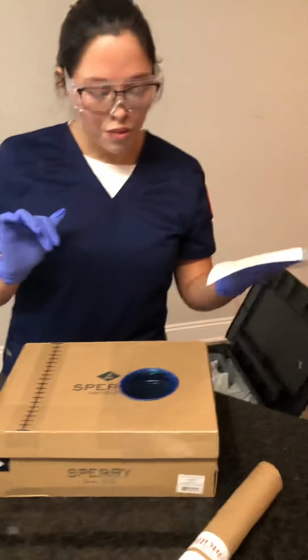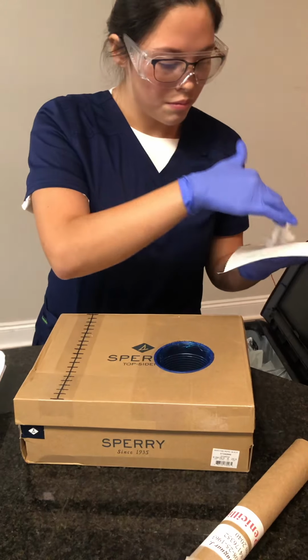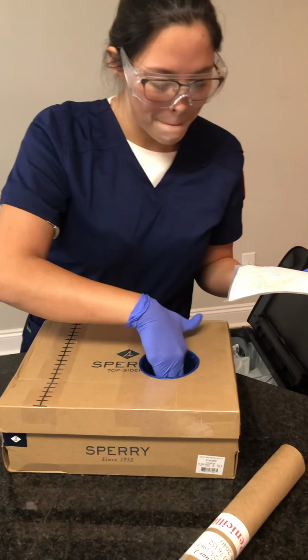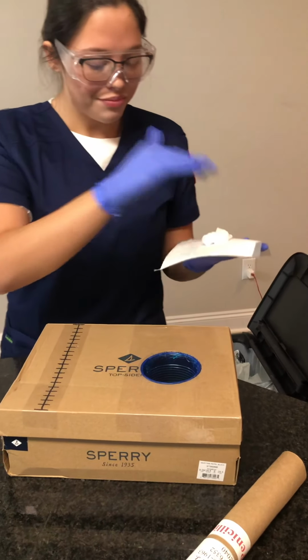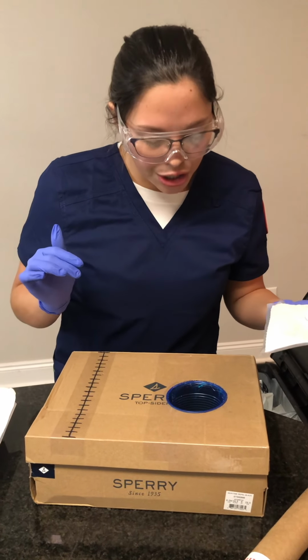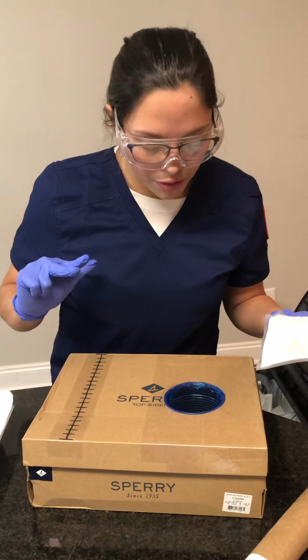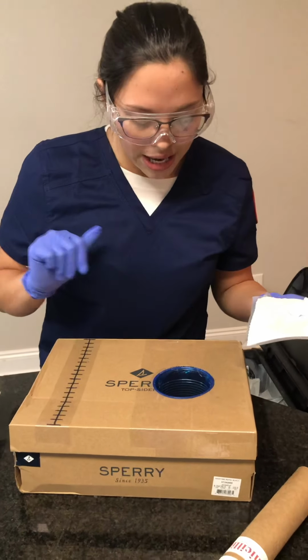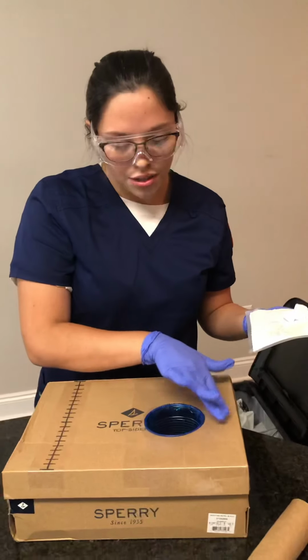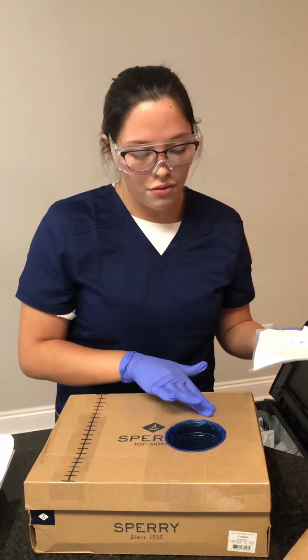I will then remove the inner packaging. I will then assess the wound for the size of it, the inner tissue, whether it's granulation, necrotic, slough, or odor, and I will palpate around the wound for any redness, edema, or tenderness the patient might have.